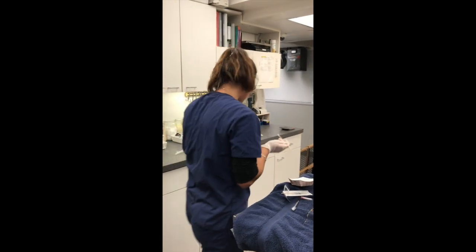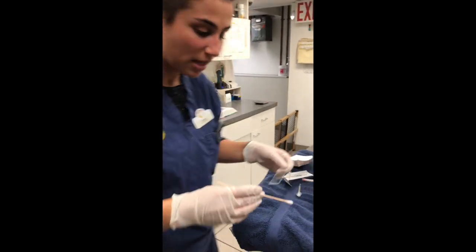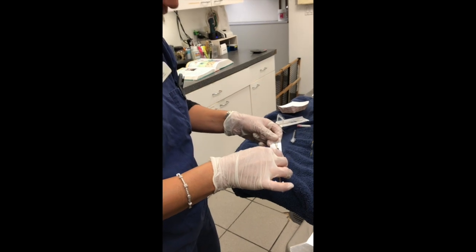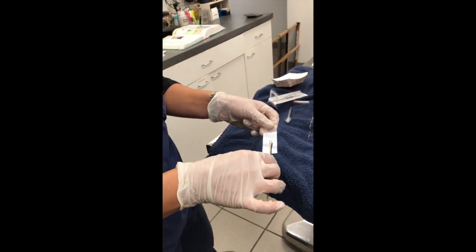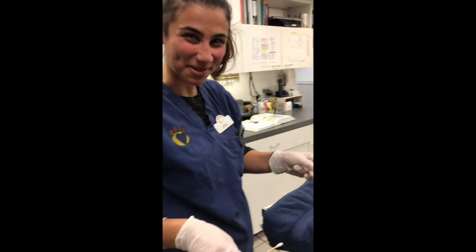I'm going to take the slide, frosted side up. Now I actually don't want to roll. I'm just going to gently brush it up against the slide. Just like that. And we have our sample.